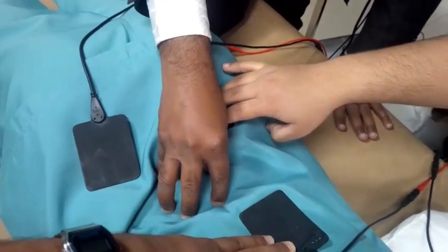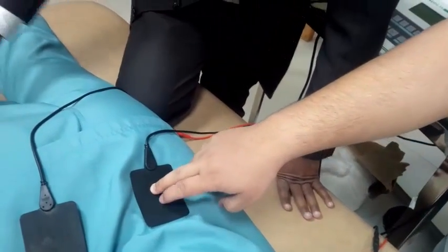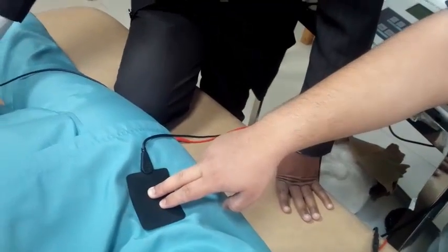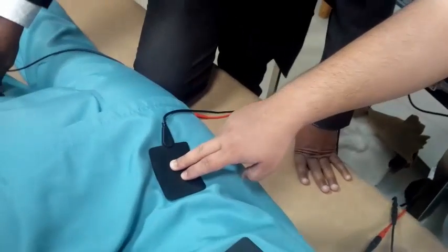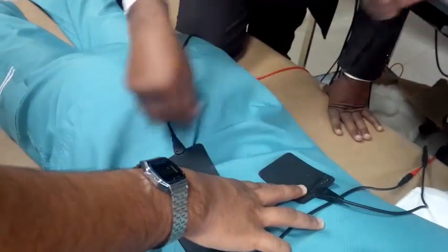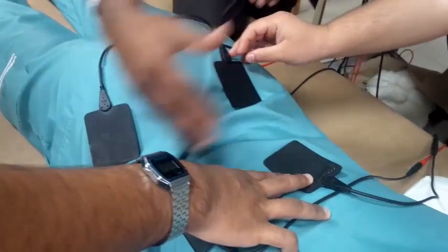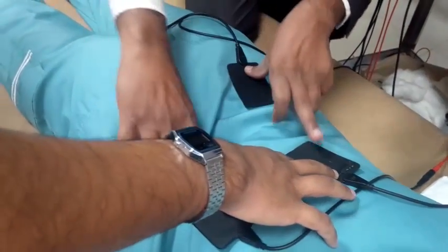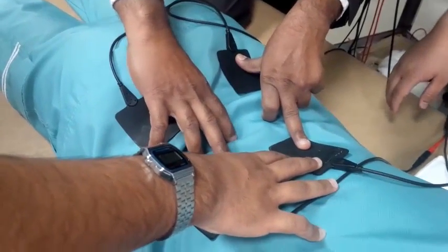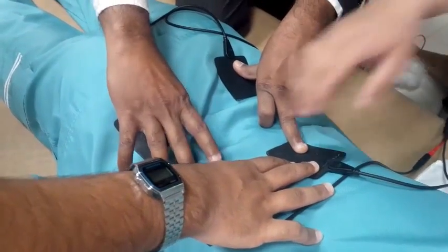You got the idea? Not like TENS treatment. Suppose the patient's pain is here on the thigh, on the hamstring muscle. You can place the electrode directly on that area, like TENS, but not in this IFT. It is not like directly placing 4 electrodes over the painful area. You have to identify where the painful area is, then place the electrodes a little bit of distance away from it. The effect will be at the center, and that is much deeper than what you get from other low frequency current modalities. Got it?